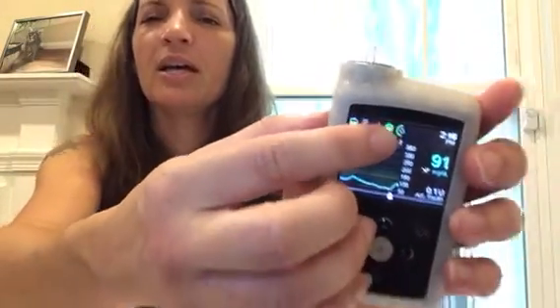So all of a sudden you'll look down and you'll see that your circle is quarter yellow. And let's say I knew that I had a calibration due in 6 hours, and now all of a sudden that's a quarter yellow circle, and I knew that I was at about 6 hours from my last calibration, well, that's a diagnostic calibration. I can give it at any time. And then I get put right back in that 6-hour window. It sounds like it's completely ridiculous, but the truth is I'm starting to be able to manipulate my pump a little bit on the first day, and that's very nice. I'm starting to own it, about this much, rather than it completely owning me.